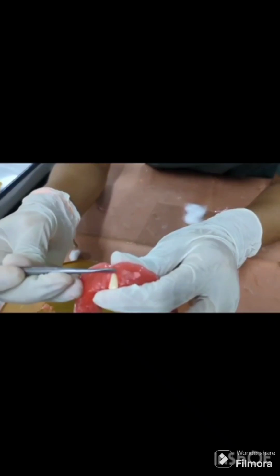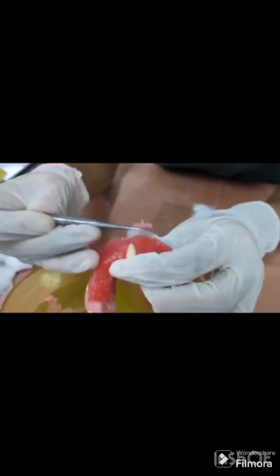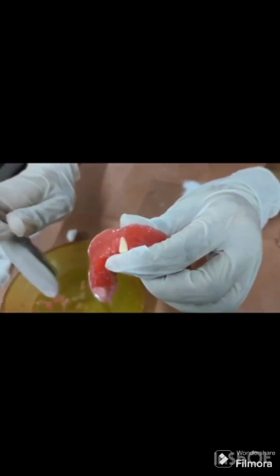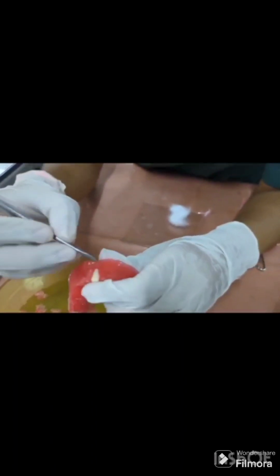It slopes labially when viewed from the side. The inclination is more pronounced in the incisal half of the central incisor and the cervical region is within the occlusal rim. From incisal view, it follows the arch form.